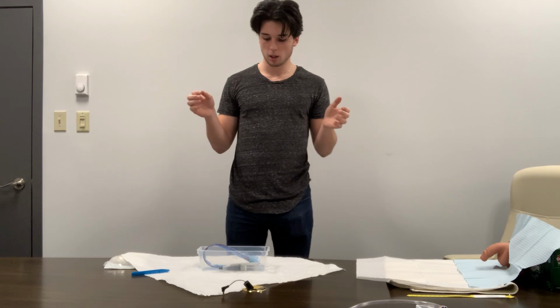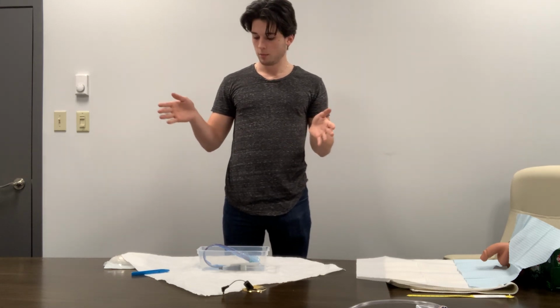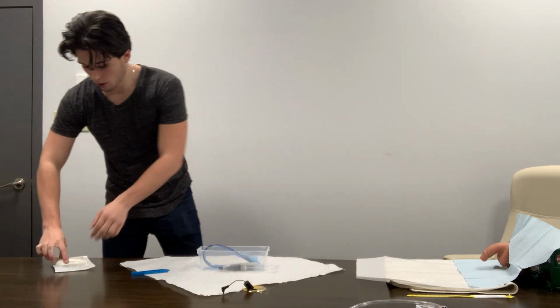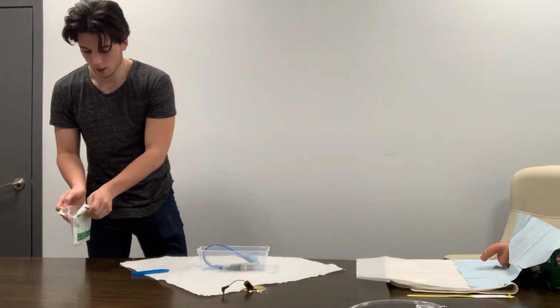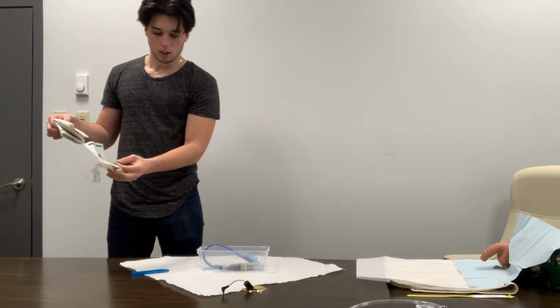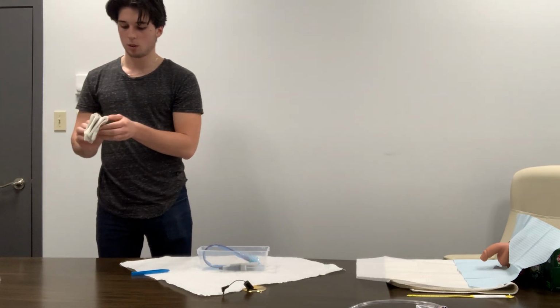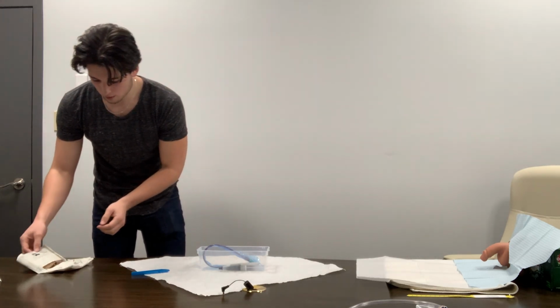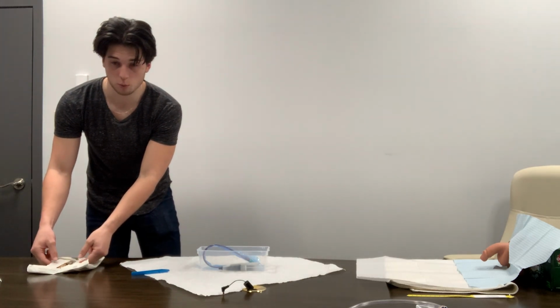So we can throw that right in the garbage, and then once that has been thrown out, we can go ahead and start donning our sterile gloves. So we are going to grab our sterile gloves out here, maintaining the sterility of these. Same with our working space here. We can only touch the 1-inch border of this area. So we're going to open our gloves here, only touching the outside 1-inch border.